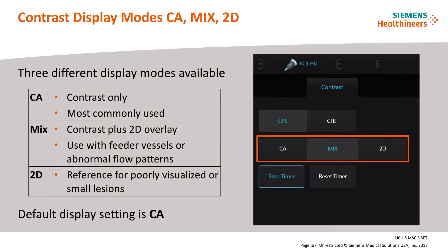Once the imaging mode has been decided, the next parameter to select is how the user will view the image on the screen. There are three types of display modes available in the contrast settings. CA, which is contrast only, is the most commonly used display mode. Mix is a combination image display mode with a 2D overlay of the tissue signal over the black contrast-only image, commonly used to visualize feeder vessels or abnormal flow patterns. The third display mode is 2D, which shows only the 2D image. The default setting on the system is set to CA and is not customizable.